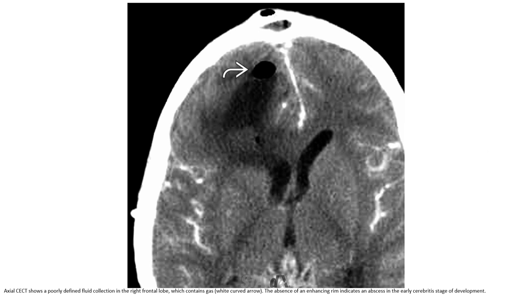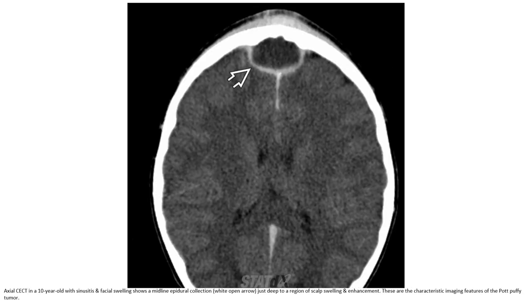This is the contrast-enhanced CT showing a well-defined fluid collection in the right frontal lobe, which contains gas. The absence of an enhancing ring indicates an abscess in the early cerebritis stage of development. Another contrast-enhanced CT in a 10-year-old with sinusitis and facial swelling shows a midline epidural collection, with enhancement — these are characteristic imaging features of Pott's puffy tumor.